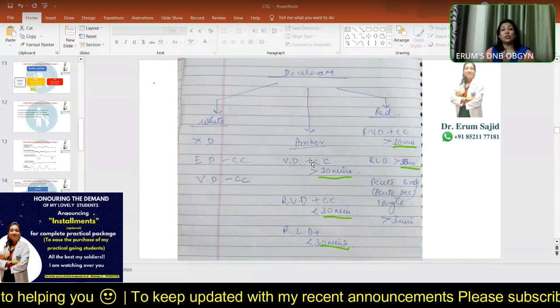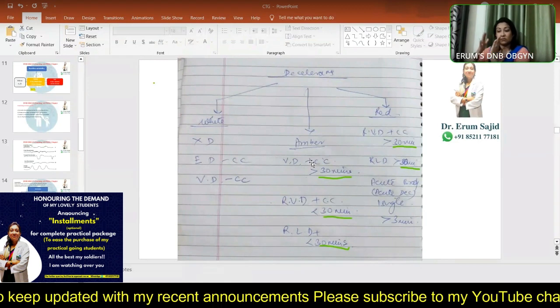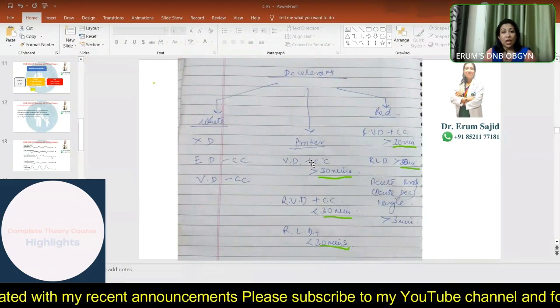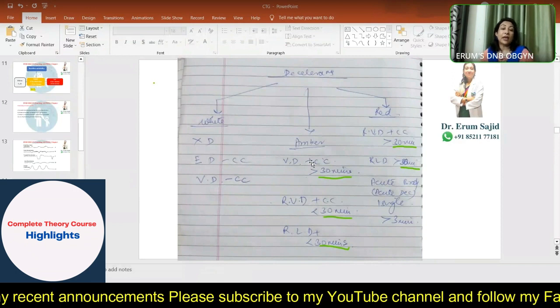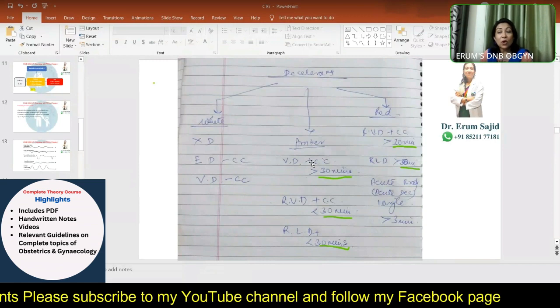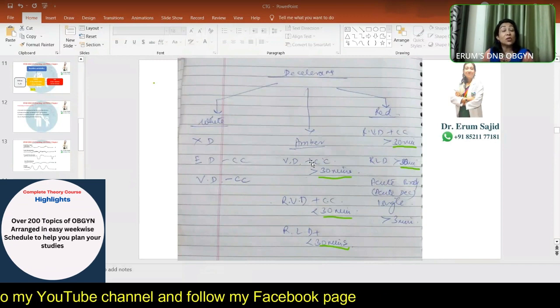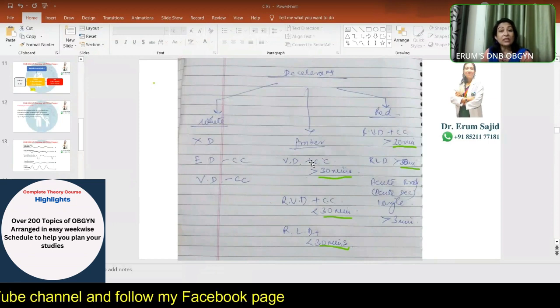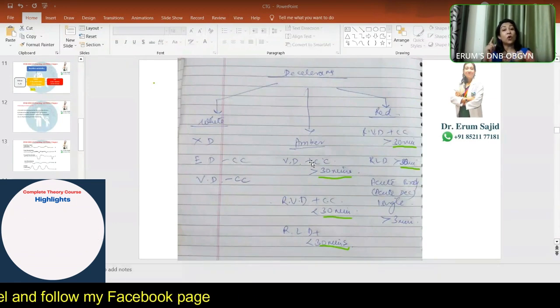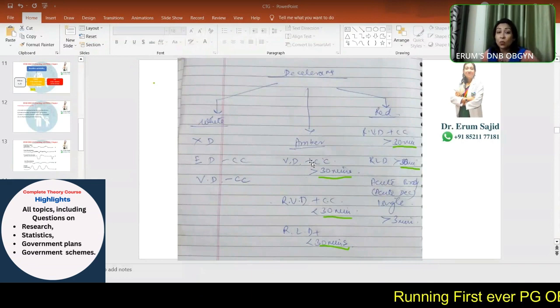When you make recommendations, they become black and white: this is right, this is not to be done. But with everything in a clinical scenario, it's not possible to make such rules, because the clinical scenario is not black and white. So even in this case, they should have talked about repeated late decelerations without concerning characteristics in the white category, but they've not spoken about it.